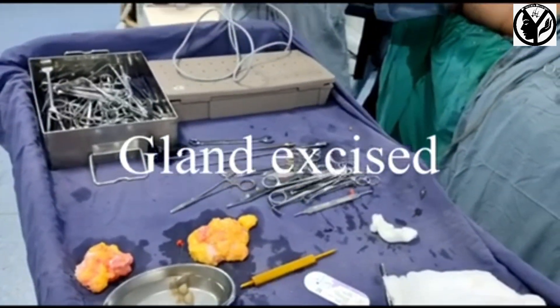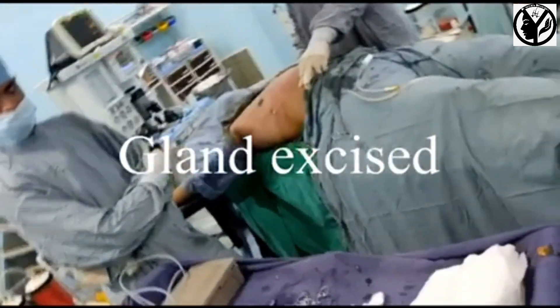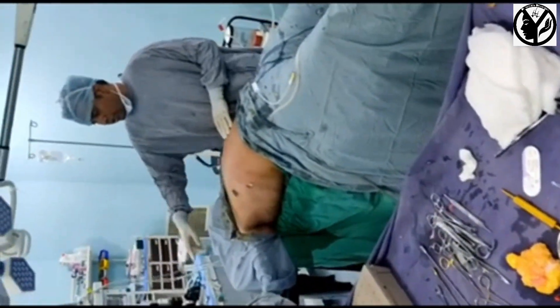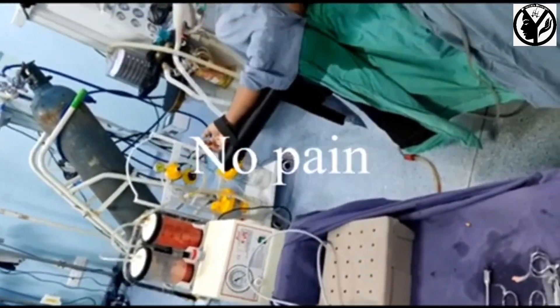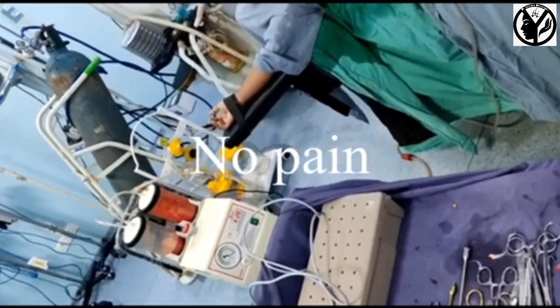One on right side, one on left side. Here we can see the collected fat is about 2000 ml.